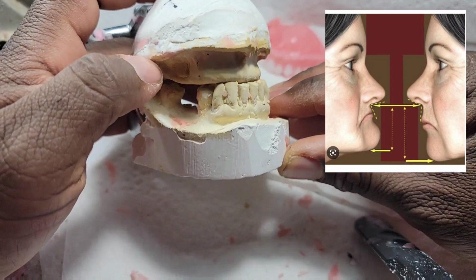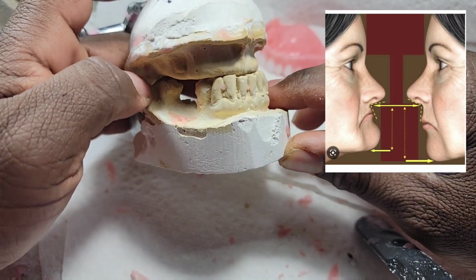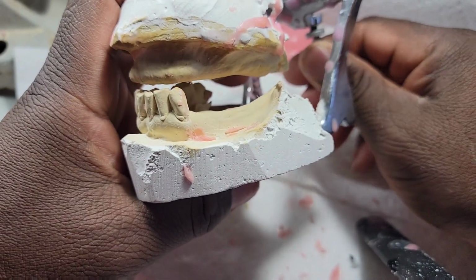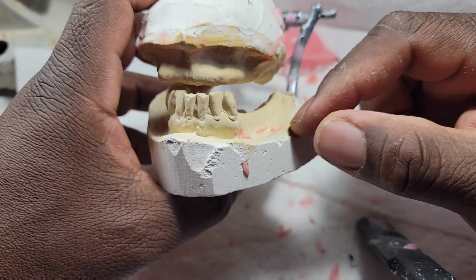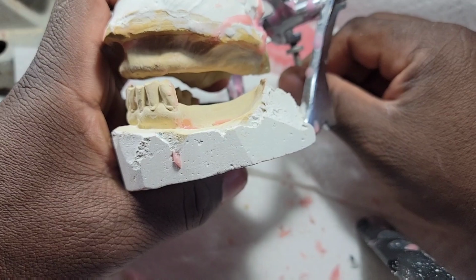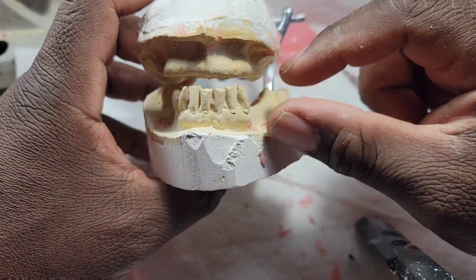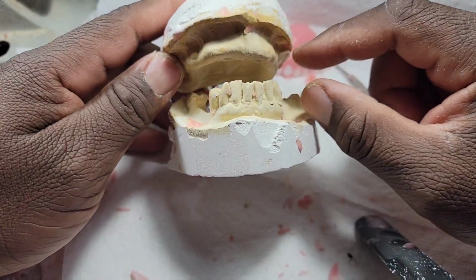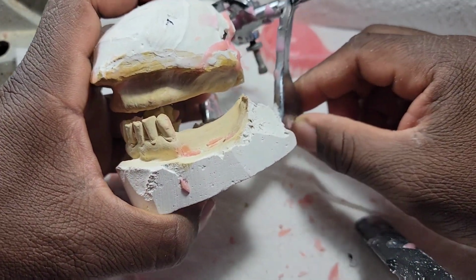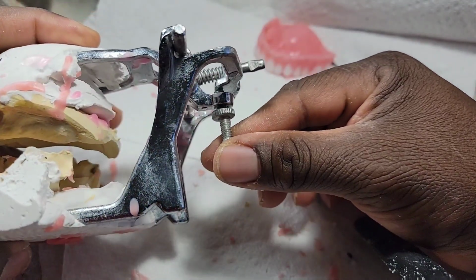For this person here, his upper bone is hitting the lower. I don't know how comfortable that would be. So what we do as a technician, by the direction of the doctor, is they might already have that measurement done in a bite block appointment. So we just mount the bite block together with the models and everything to articulate it in a way that was already set up for us, and then we set the pin back there.